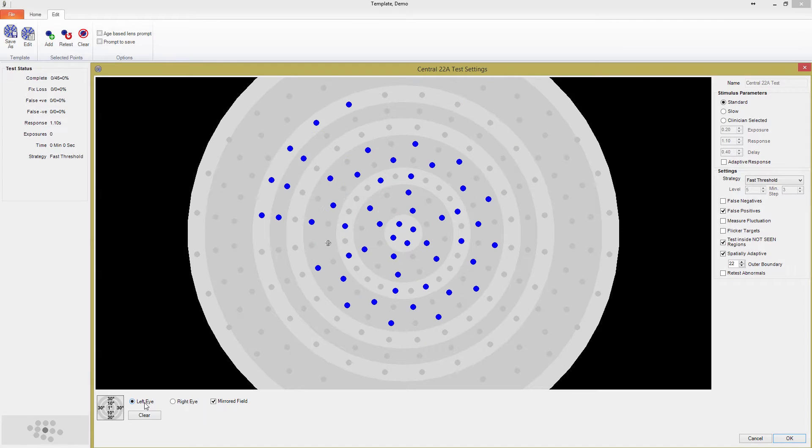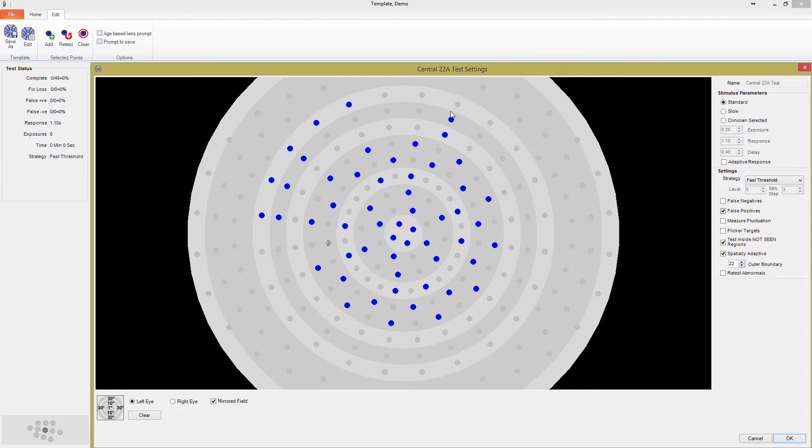As you've likely noticed, to add a point, you simply press on a grey stimulus location. You can either click on points individually, or hold down the mouse as you move over the stimulus locations. Pressing on points that are blue will remove them.